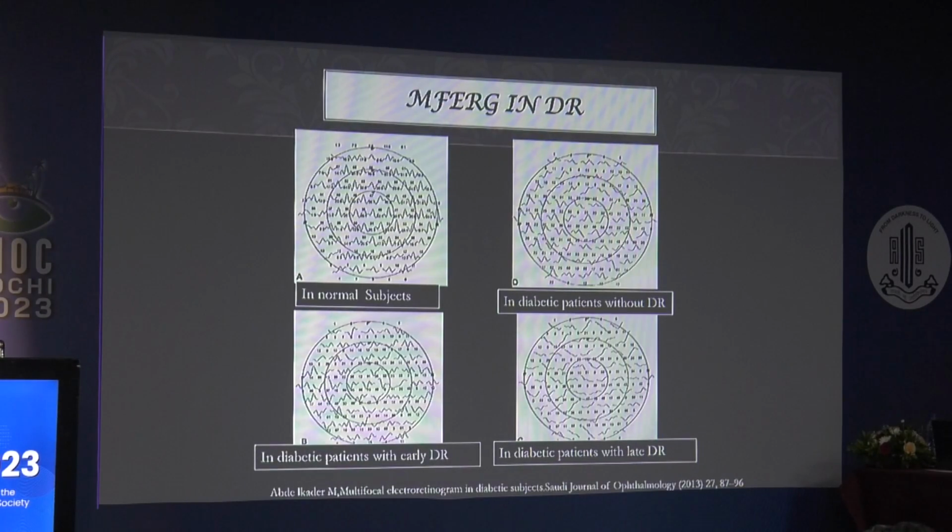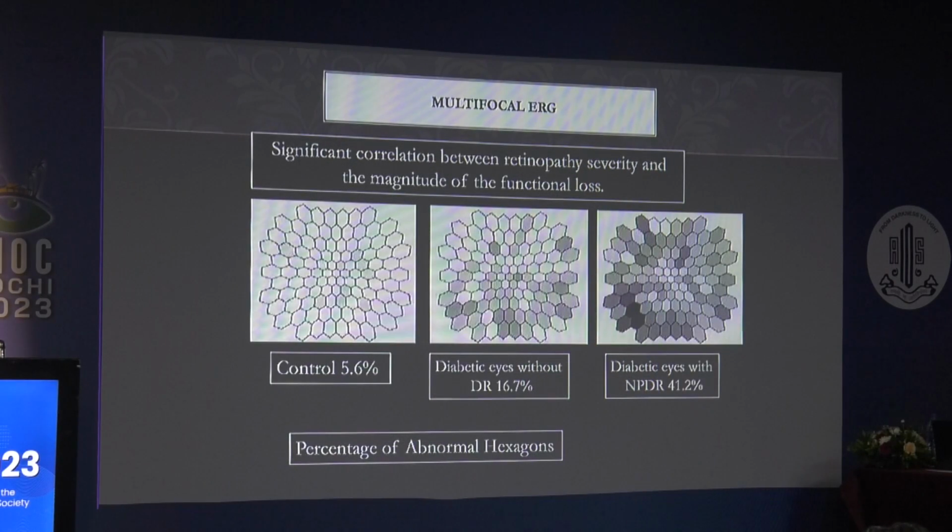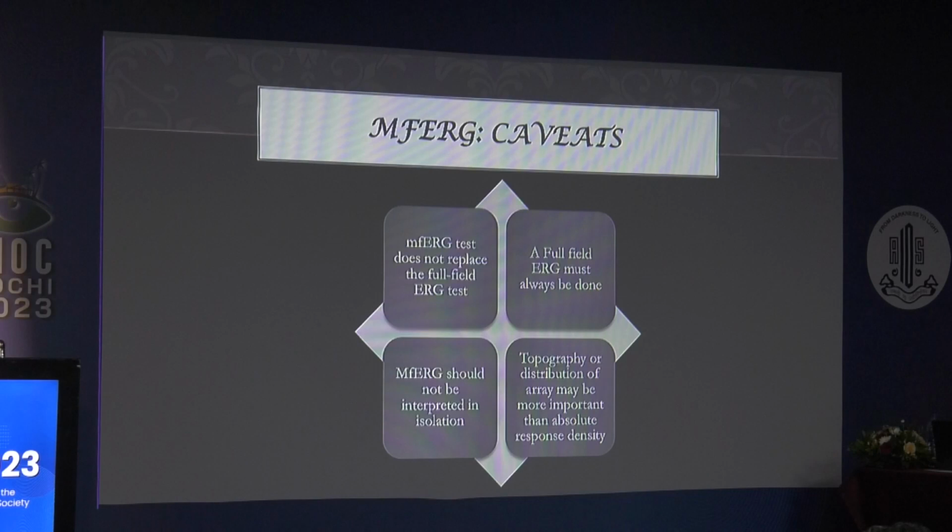You can see even in patients without DR, how the multifocal ERG is already disturbed. Increased latency, low amplitudes are seen even in the absence of any structural changes. Again, same example, that even patients without DR, multifocal ERG can be down.